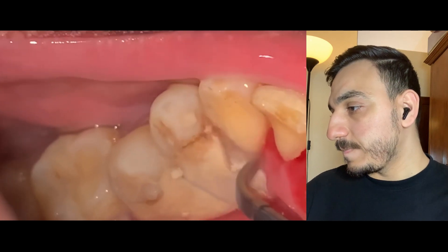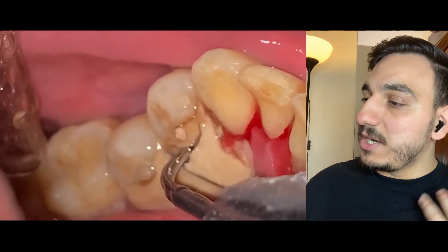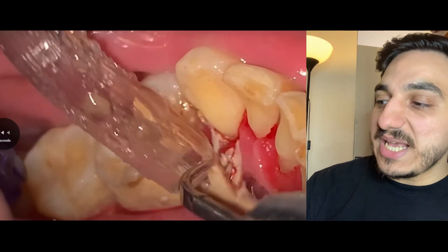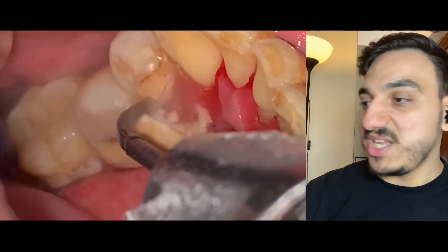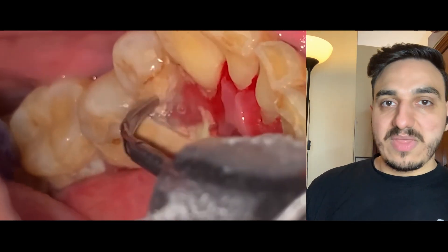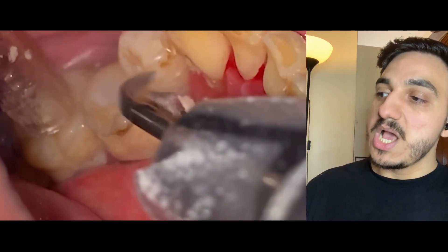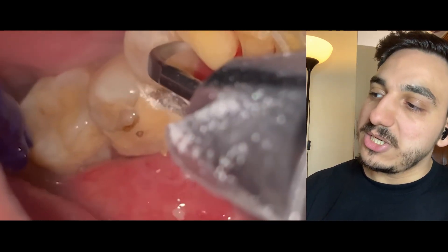The operator proceeds to the other side — look at these huge chunks. The assistant tried to suction a piece but it wasn't feasible, so they used a tweezer to take off that huge piece of dental tartar. The operator then proceeds from the lower anterior teeth into the lower posterior teeth on the other side.